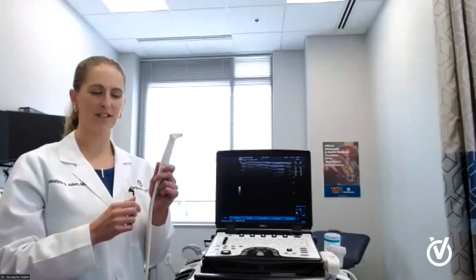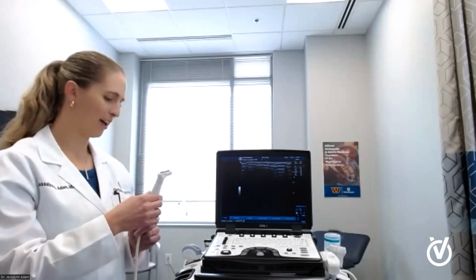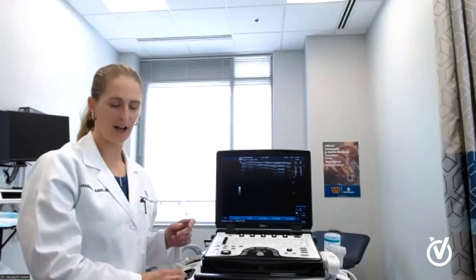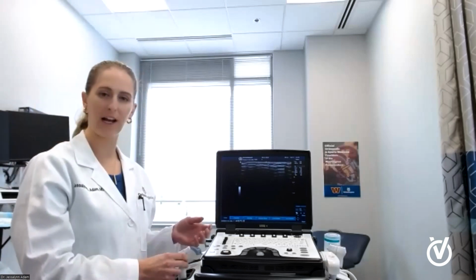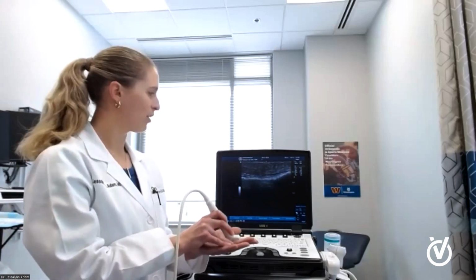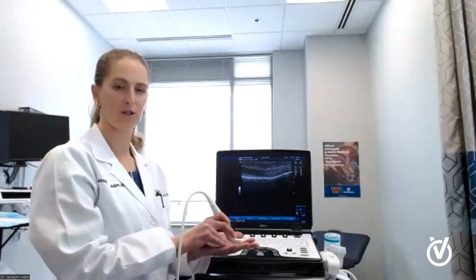Thank you. What was the thing that you were using on your skin, the white thing? What is that called? And are there different types of them? Yes, so this is an ultrasound probe. This one is affectionately named the hockey stick. And they all have different frequencies. So ultrasound is sound waves. And basically the image is made by those waves coming back to the probe. So depending on the probe that I use, my image will change. So this is what we call a high frequency probe. And so you can see the superficial tissues in really high resolution.